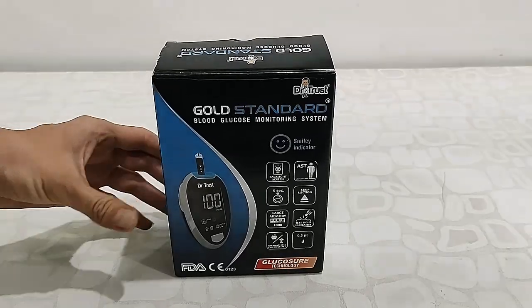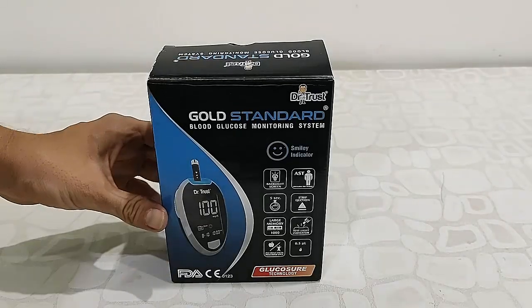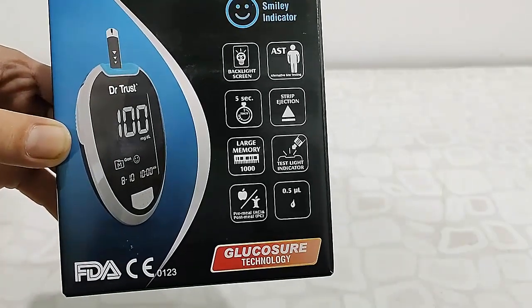Hey guys, welcome back again. I'm MJ. Today we're going to do a quick review, unboxing, and how-to-use of this Dr. Trust Gold Standard blood glucose meter. Let's first quickly unbox this and see what we're getting out of the box.